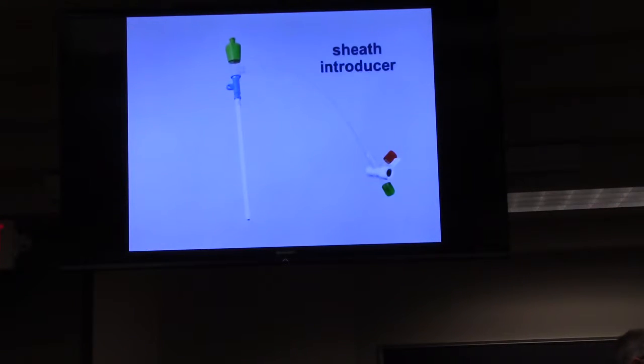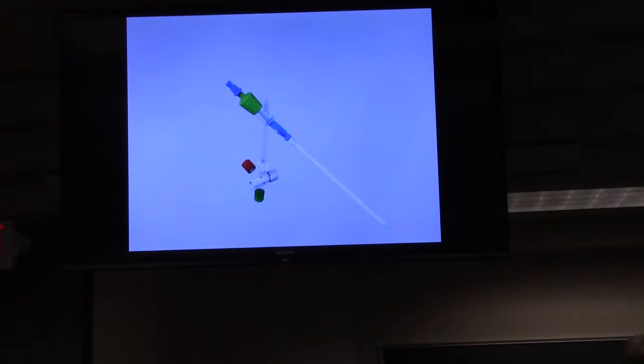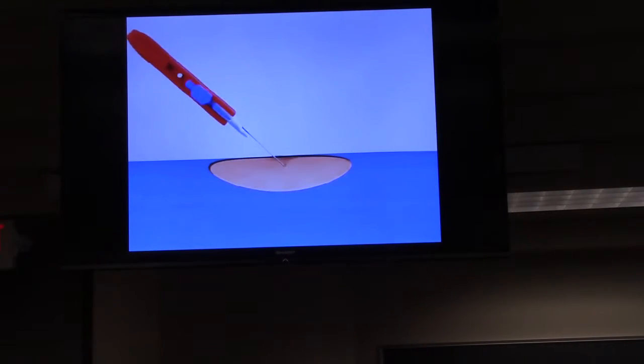If using a sheath introducer instead of a triple lumen catheter, the technique is slightly different. Fully insert the dilator into the introducer prior to the procedure. Once the guide wire has been placed, insert the dilator and the introducer as a unit into the vessel. Once fully inserted, the dilator and the wire may be removed together.